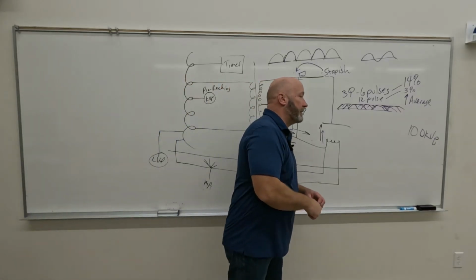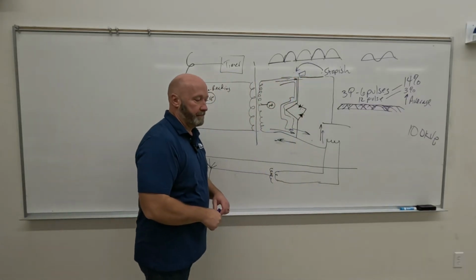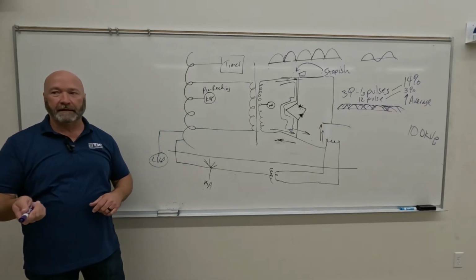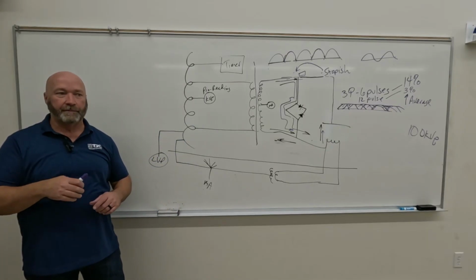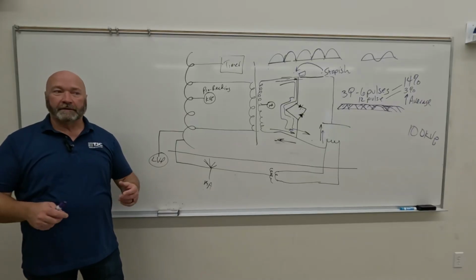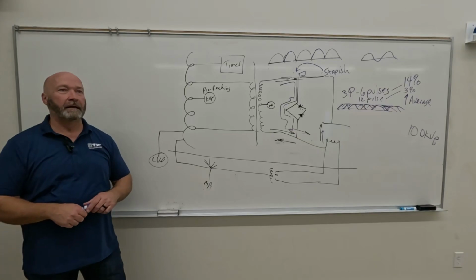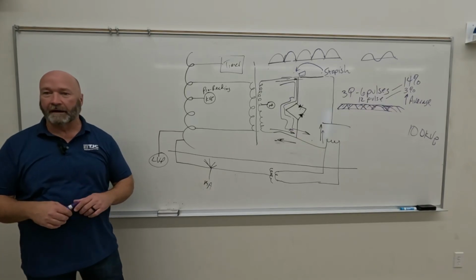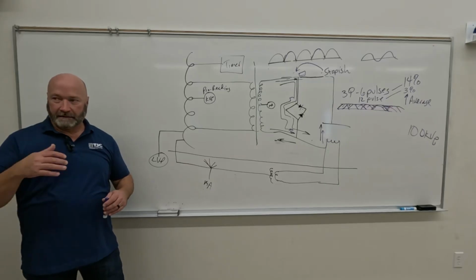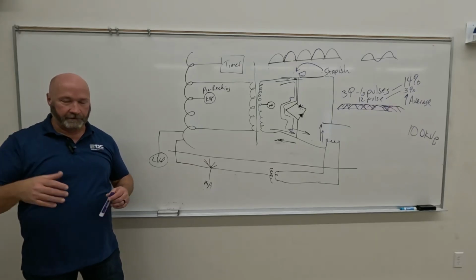Well, maybe not, maybe not. So, have you worked with a portable machine that you had to plug in, not to charge the batteries, but to make an exposure? No? Okay, they're out there. I think most of them actually carry around a generator inside of them to take voltage and make kilovoltage.